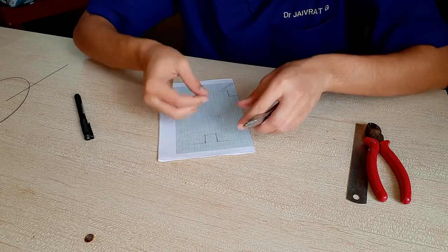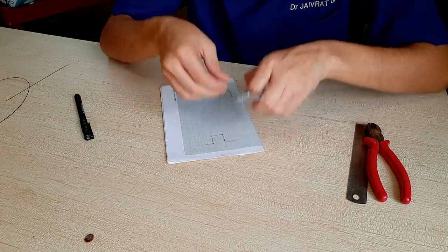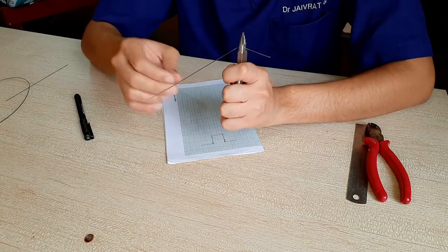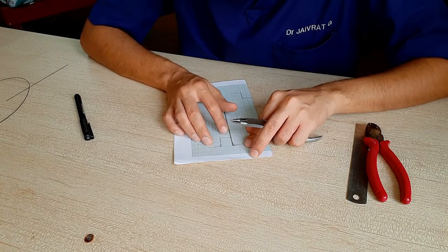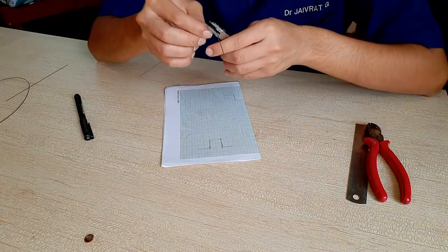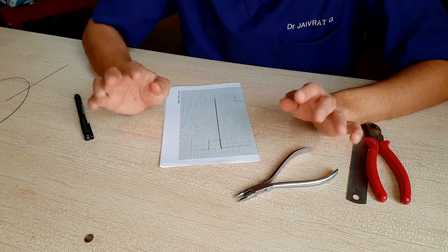Now if we see here, I have actually overbent it a little — it's not perpendicular to this line. So what you have to do is you hold it between the plier like this and just open it a little bit. Now once you've done that, you can see that it's sitting. A little bit is still left — almost there. Okay, it's completely sitting now.